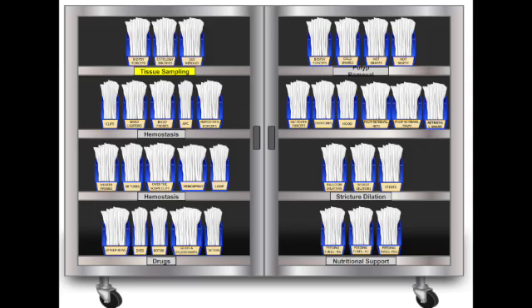Two main methods: balloon dilators. These are catheters with inflatable balloons of various sizes. Where are they used? Highly versatile, used for strictures pretty much anywhere. Esophagus, pylorus, stomach outlet, colon, connections after surgery, anastomoses, and also in the bile duct and pancreatic duct during ERCP.